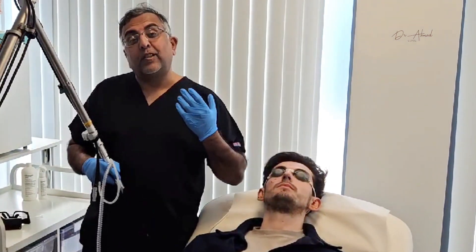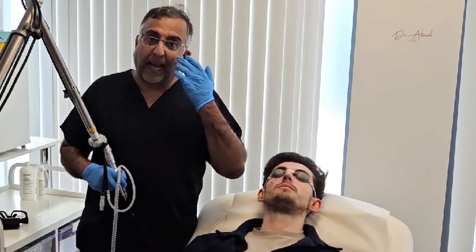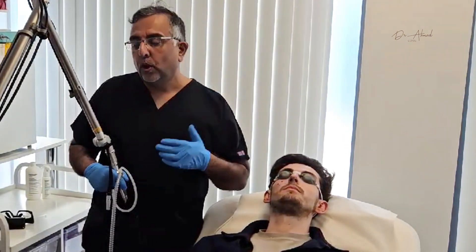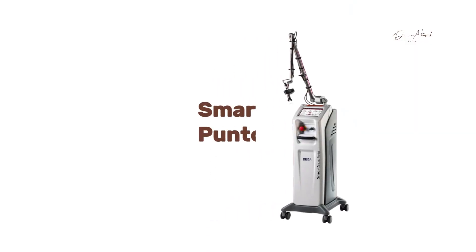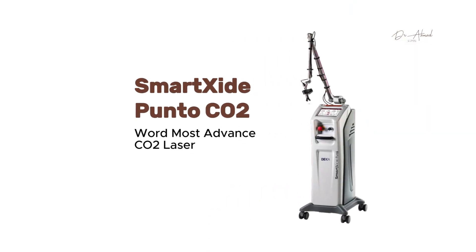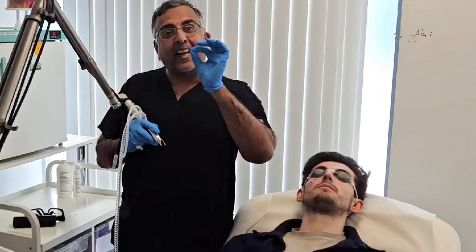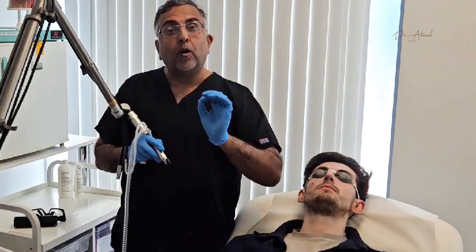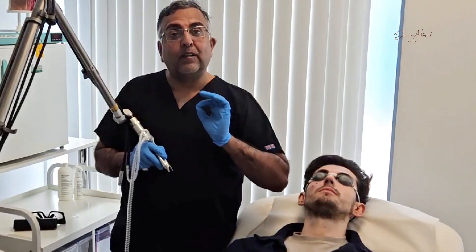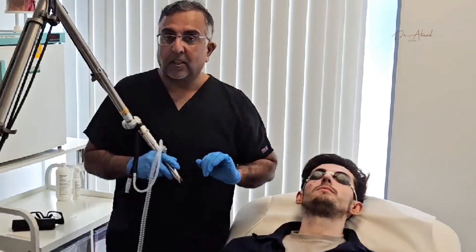So what we're doing is we've got our DEKA SmartXide Punto CO2 — it's the world's most advanced CO2 laser that's out there — and we've got this in surgical mode. What that does is it actually takes down and gets rid of the mole to the base of the skin without having to cut the skin or leave a scar from any surgical procedures. So we'll show you how this is done.